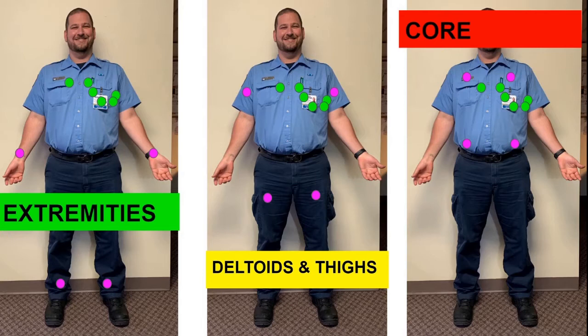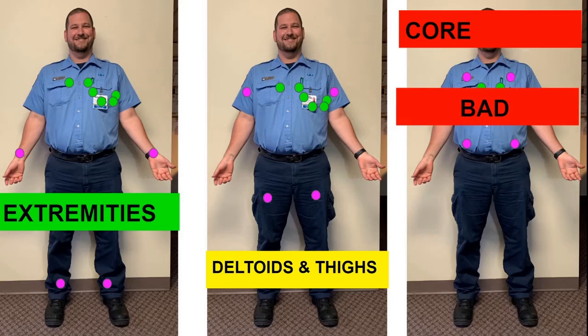But the hospital does it, so wait. Why do they get to do it? Well, their machine, their algorithms are calculated differently than our machine and our algorithms. And so the hospital can put them where they are trained to do so, and we are going to place the limb leads where we are trained to do so. And the manufacturer says that they are limb leads and not core leads.